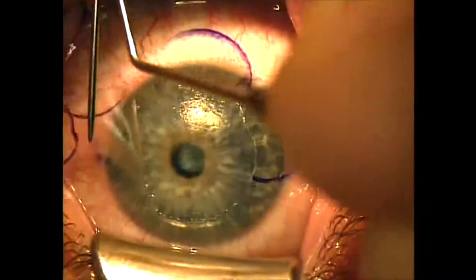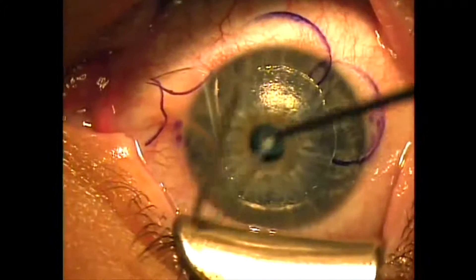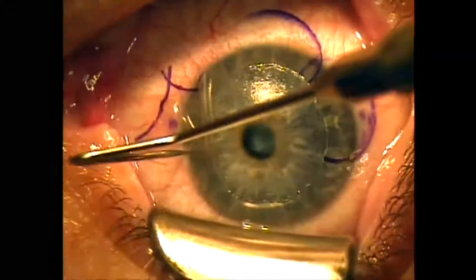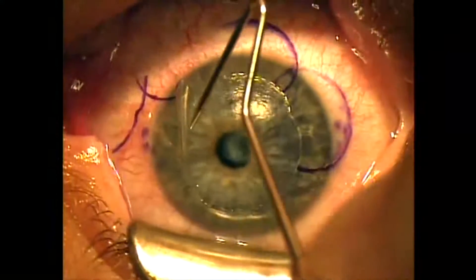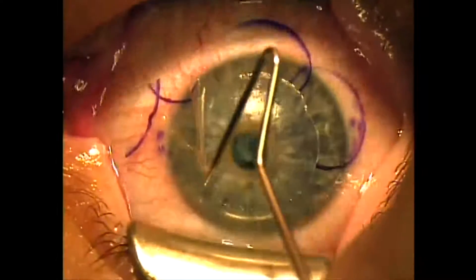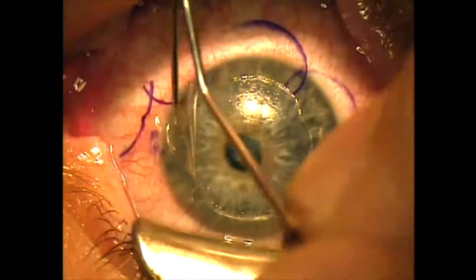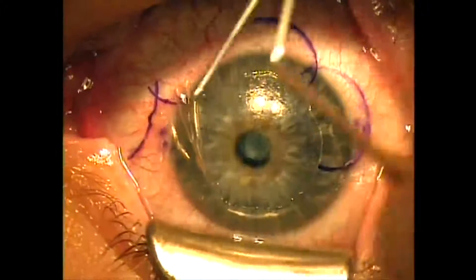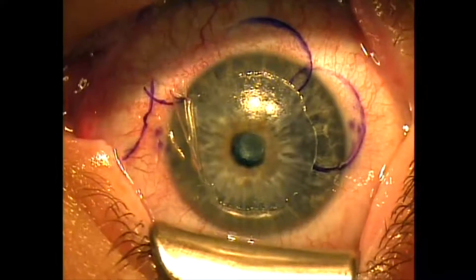We keep the bed dry, and then we center our focus on the stromal bed, turn on our tracker, engage iris registration, and deliver a very brief hyperopic ablation.